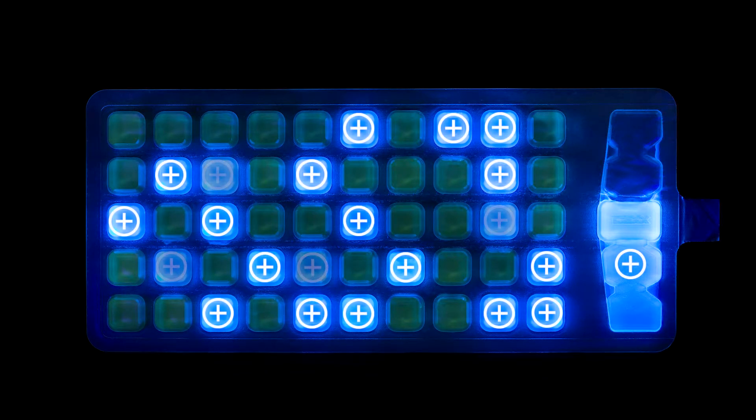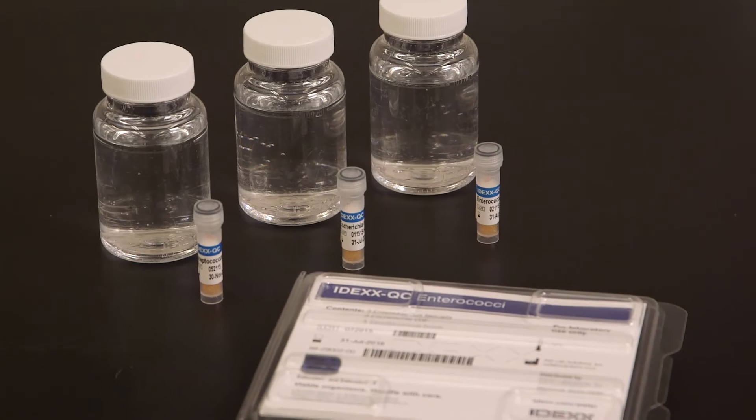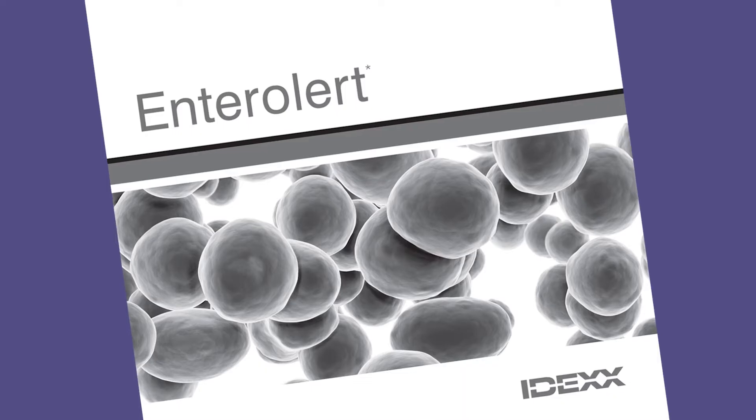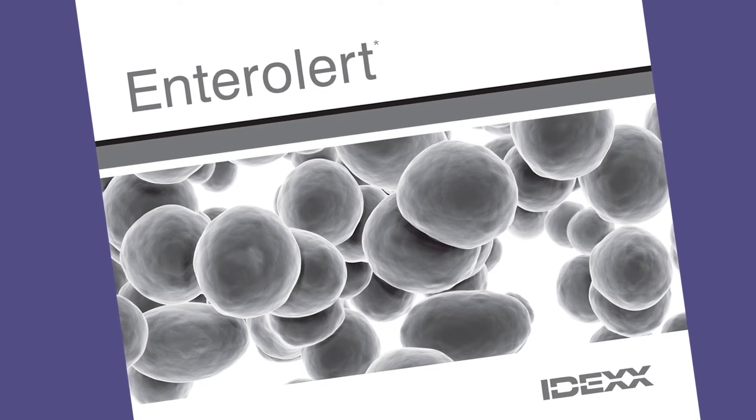If you're unsure whether a result is positive, compare the samples side by side with a known negative sample. If the results are ambiguous based on the initial reading, incubate up to an additional 4 hours, but not to exceed 28 hours total, to allow the fluorescence to intensify. IDEXX recommends that you run a quality control procedure for each lot of Enterolert tests. You will find the quality control procedure in the Enterolert product insert.